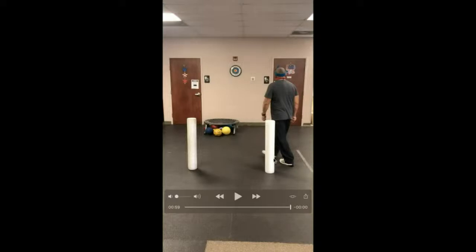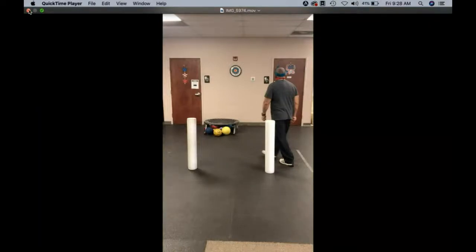I also chose white versus blue foam rollers for him. And foam rollers versus targets on the ground, because he has to consider getting around a larger target without having to look down. If you're just going to step on a target on the ground, that might not have as much of a consequence versus knocking over a foam roller. So it really encourages and motivates the patient to get around that area, and you can look at their pattern. Just stepping on targets or around targets on the ground might not give you as much information about where their deficits are.